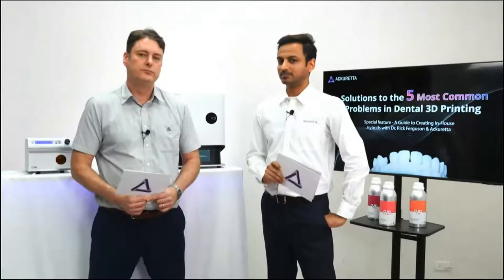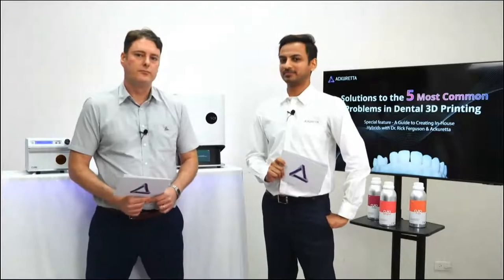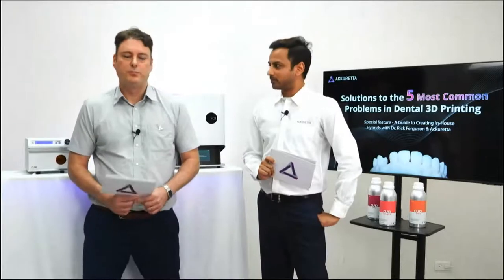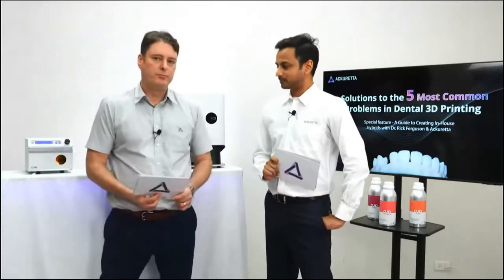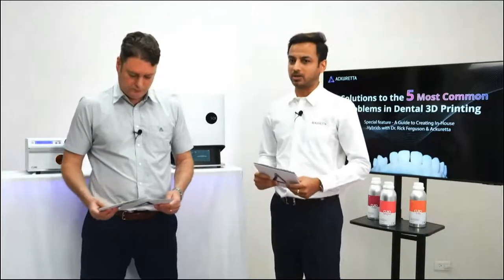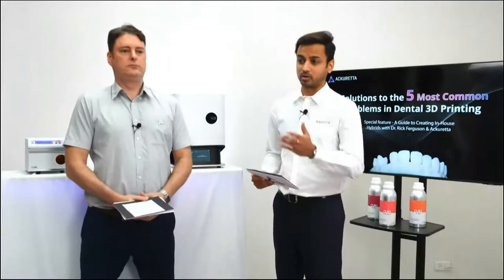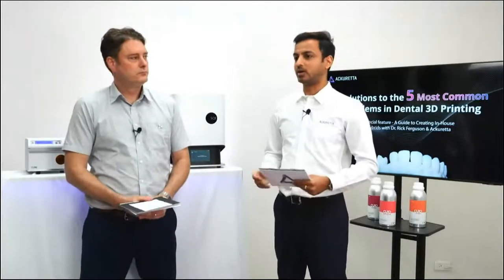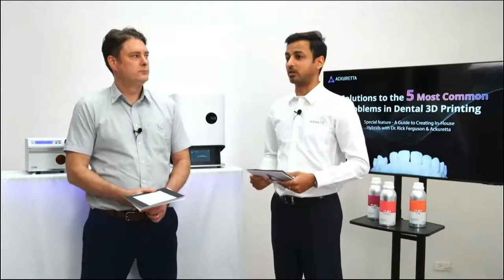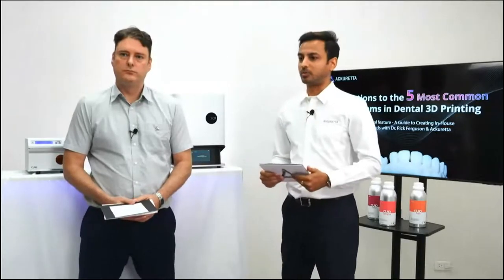There's another one. Ganesh Nayak is asking, what is the material used for permanent crown? Well, I would say there's two materials that we find in the market currently that are certified for permanent crown restorative applications. The first one is from Bego, and they have one called Varseo Crown and Crown Plus. So that's a really good material from our findings.